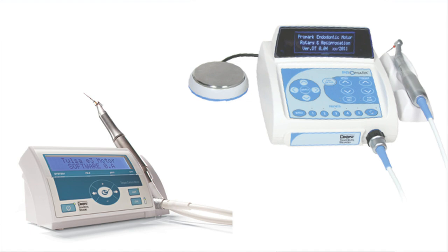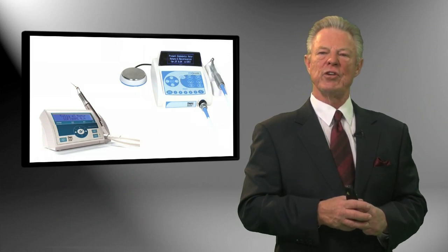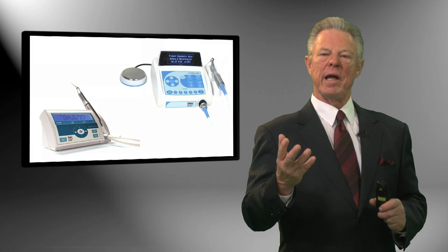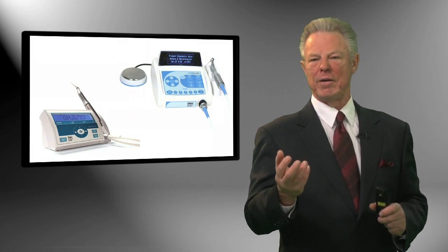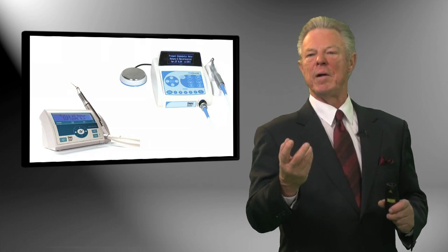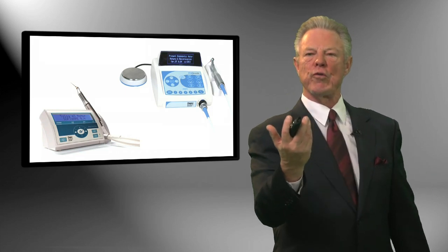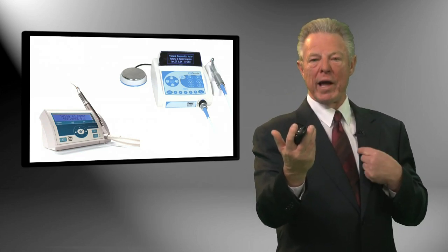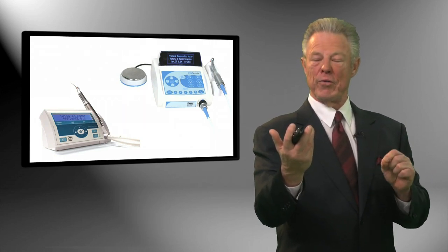What I want to say though is how you hold the handpiece. And what I would encourage you to do is hold the handpiece between the end of the handpiece and the cord, as if you were holding perhaps a cigar. Or maybe you were just pausing to hold your hands like this. And literally, you're going to cradle the handpiece. Because if you have, or we have, a glide path, no rotary, no glide path.